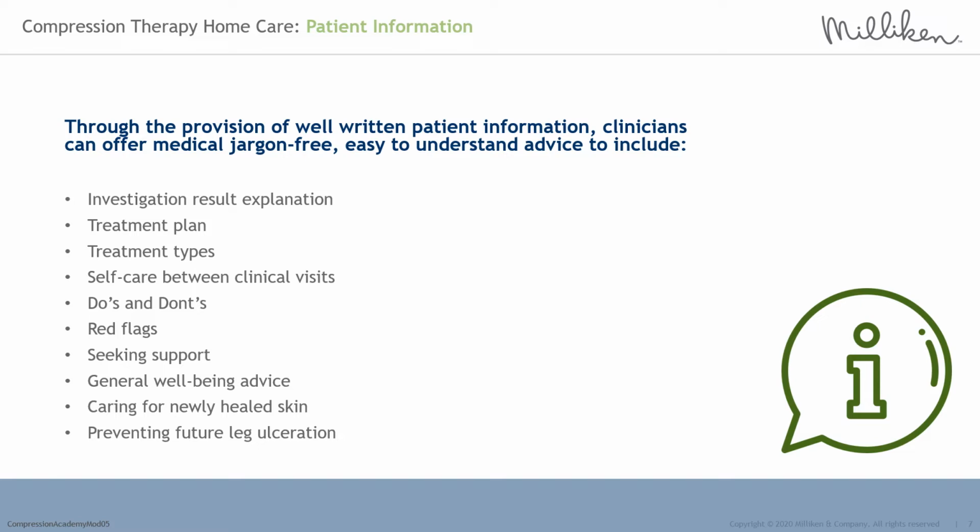Often practitioners relate to plumbing and boilers or roads and roundabouts to explain the blood flow and pressure within the lower limb, and ankle brachial pressure index as taking blood pressure as you would normally in the arm but also on the leg. We will discuss this further shortly.